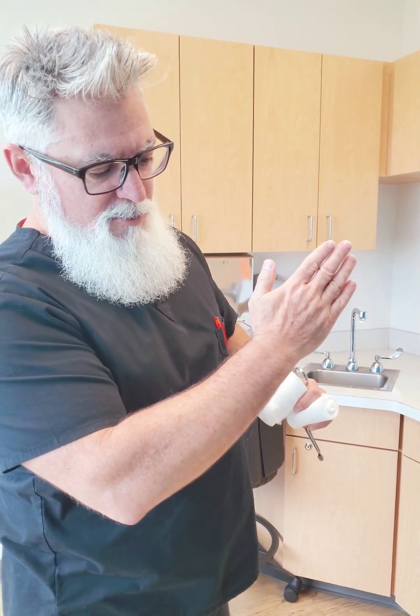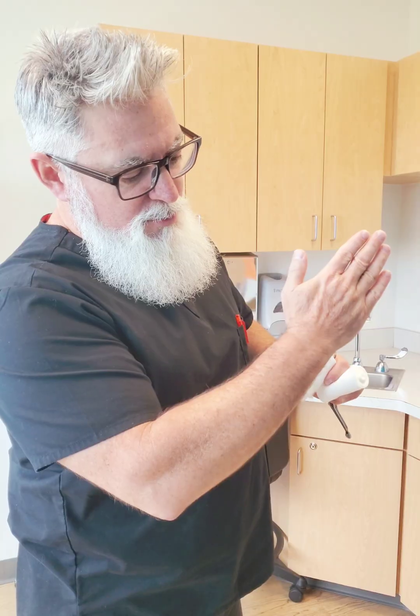So the cast, which would normally be a neutral cast — a nice straight short arm cast — we're going to do it with an ulnar deviation. And we're going to talk about why the provider would order that. So we're going to go ahead and get into that right now.